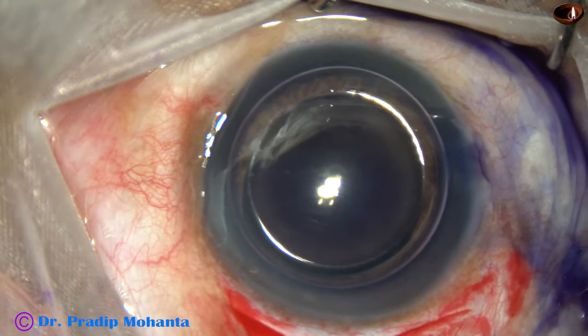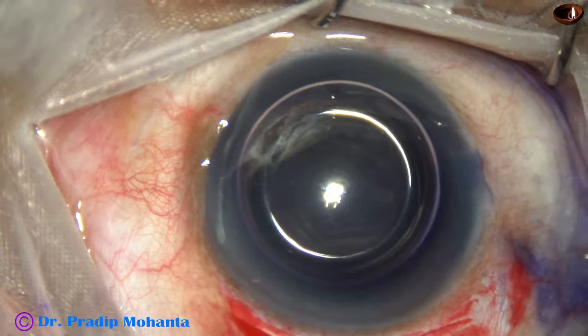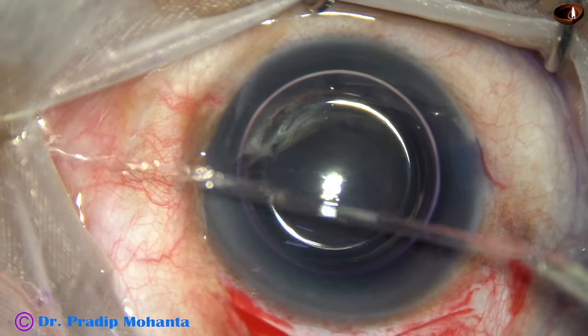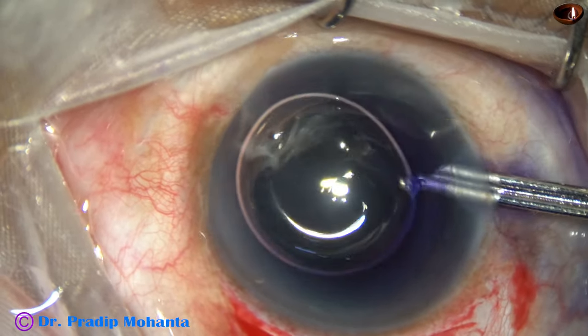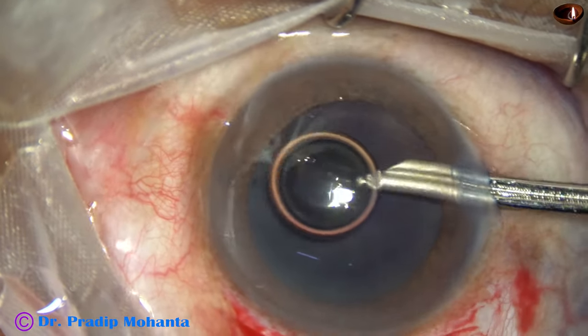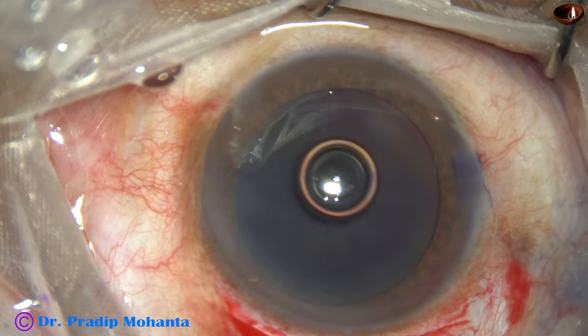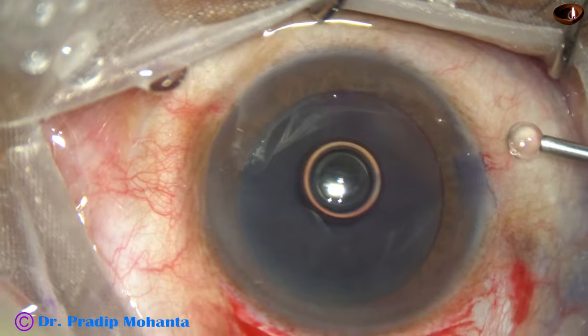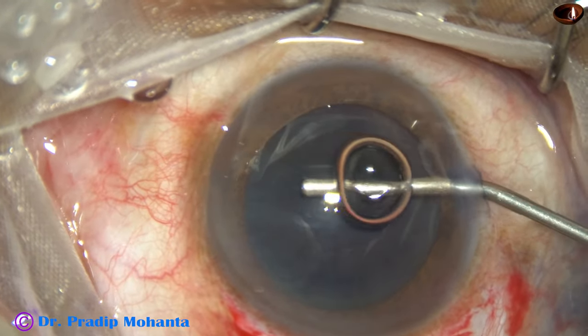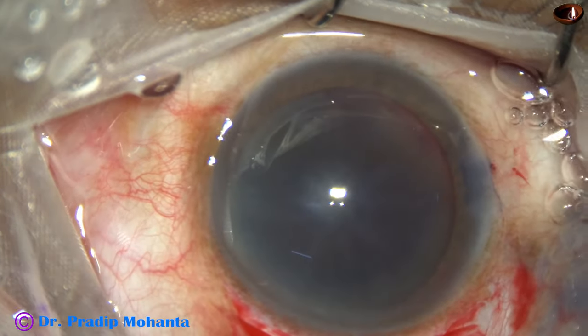The anterior capsule is stained with trypan blue dye underneath an air bubble. The dye is washed out with a Simcoe cannula. The anterior chamber is then filled up with 2% hydroxypropyl methylcellulose.